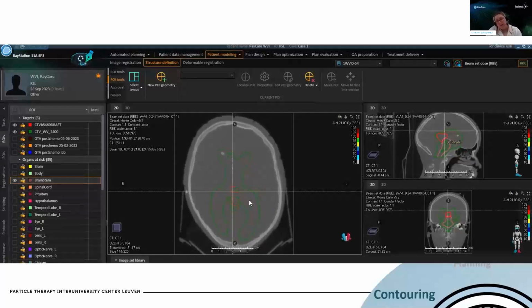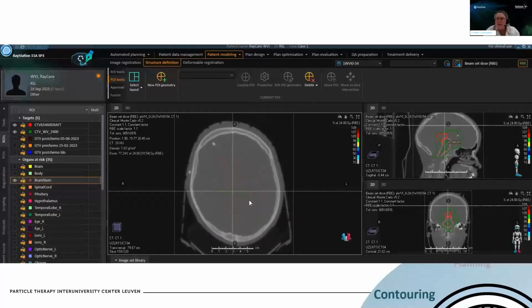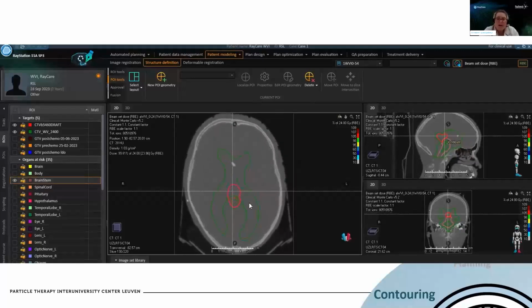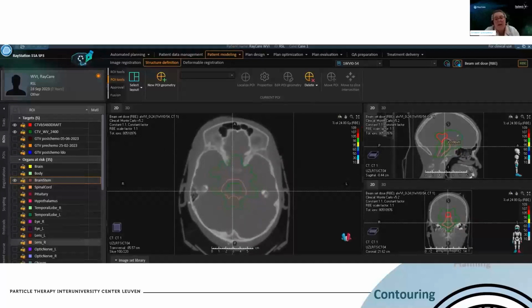And for the purpose of making this use case a bit more interesting and challenging, our radoncs let us know that they require additional MRI imaging. So therefore, the CTV boost volume is still in draft. And anecdotally, I would say this lateness of the boost happens actually quite often in our clinic, especially for CSI cases. So I would say the fictional complication that you see here is very much based on common occurrence within our clinic.